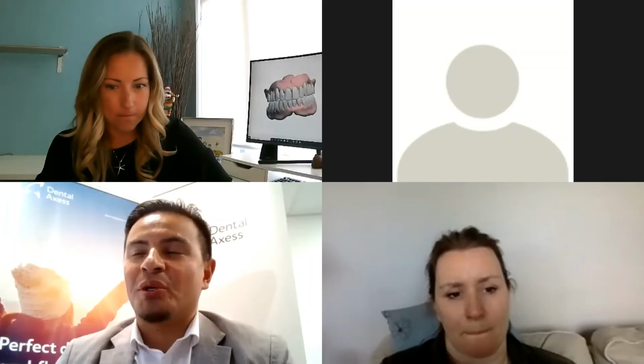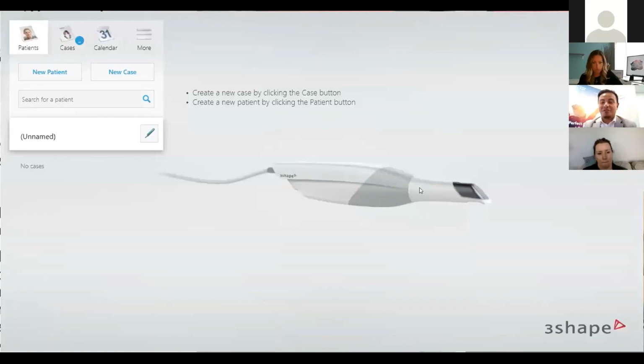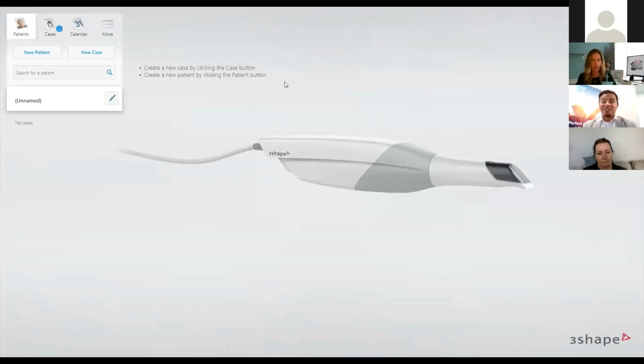While you're doing that, I just wanted to point out, Tanya, that I remember when I trained Tanya back in September, she was always very excited about the smile design. And I didn't know that she had all these plans in the back of her mind, but I am really happy to see what I'm seeing right now. So kudos to you. I mean, the patient application, I learned a lot with Tanya utilizing that application. You really took the bull by the horns with this one. So awesome. Well, thank you.